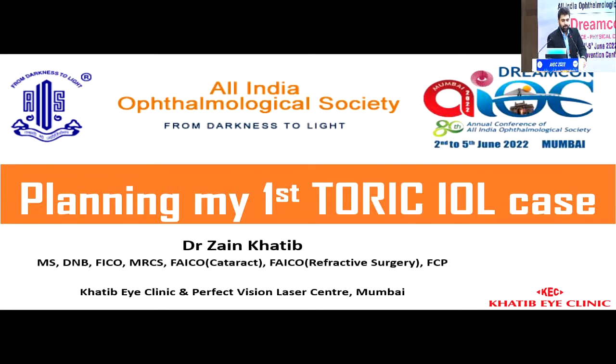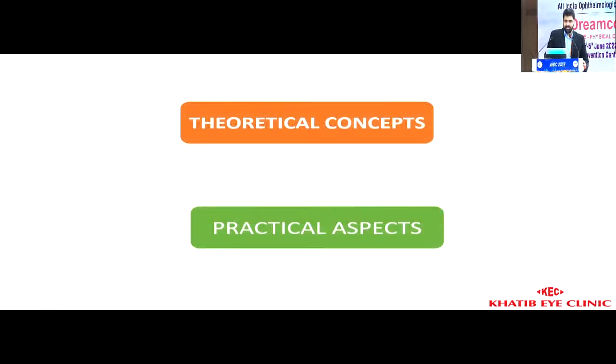Right. So, planning my first toric IOL case. Toric IOLs are not very difficult to do once you do a good phaco surgery or even probably an SICS surgery. It just needs understanding of a few things, and that is what I'm going to be discussing here.